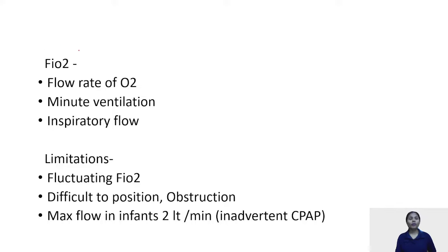When we are talking about the FiO2 which is being delivered, it depends upon the flow rate of the oxygen that you're giving, the minute ventilation of the patient, and also the peak inspiratory flow rate of the patient. It is just a revision which I'm doing. I just told everything about it.